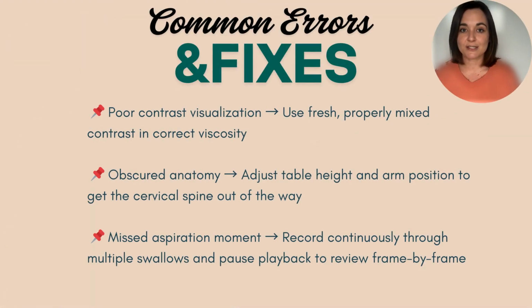Common errors and fixes. Poor contrast visualization: use a fresh, properly mixed contrast in the correct viscosity. If you have obscured anatomy, adjust the table height and arm position to get the cervical spine out of the way. If you have a missed aspiration moment, record continuously through multiple swallows and pause playback to review frame by frame.